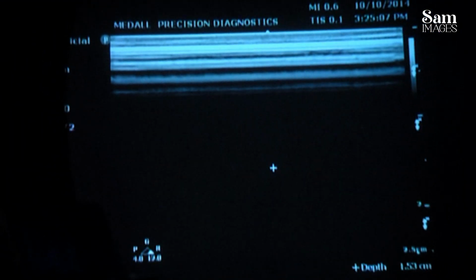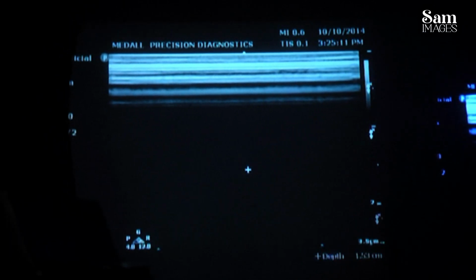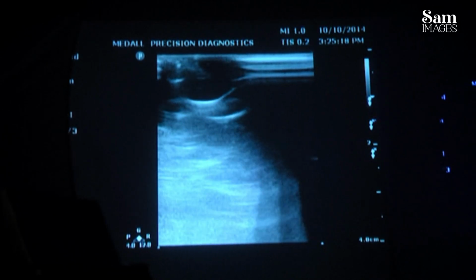Now I am going to do this first, the apical lesion, periapical lesion on the right side of the patient. Okay, that side is without any lesion.